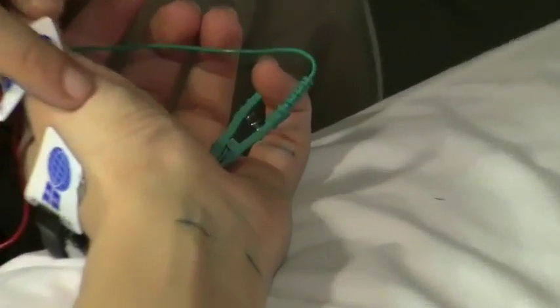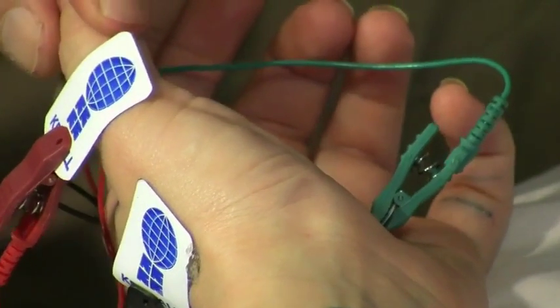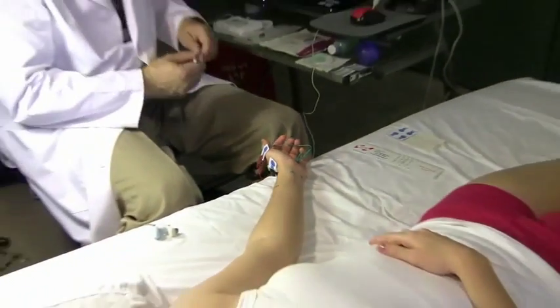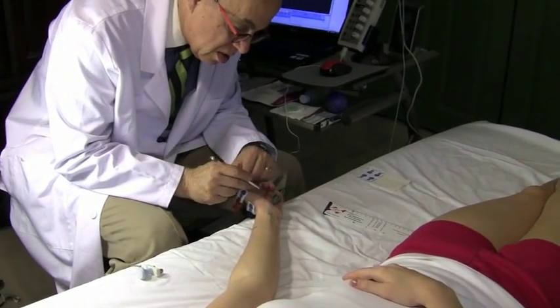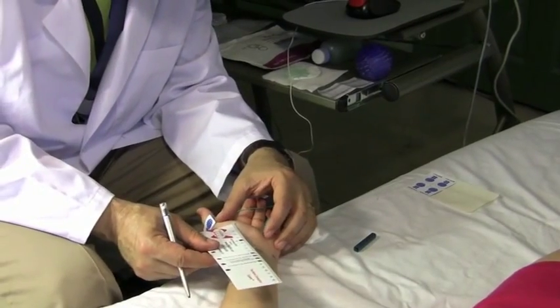And you can see how the muscle is bumping up here. Now relax. Now push it up again. Now relax. So now I see where the muscle is. So what I'm going to do is mark up the muscle, which is about, push up again, which is about right here. Okay. And I'm going to measure 5 centimeters.